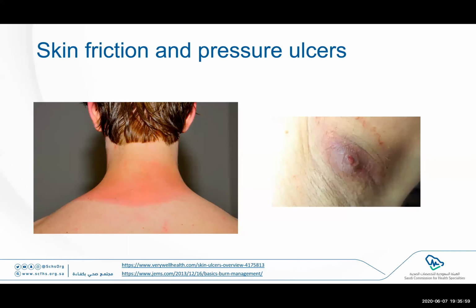One of the commonest issues, especially with prolonged use in patients who stay on the helmet for 24 hours plus, is skin friction and pressure ulcers in the armpits and around the neck. So for the pressure ulcers and the burning sensation, applying a talcum powder helps a lot.